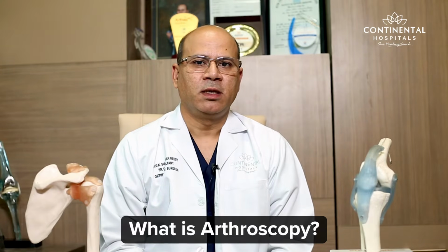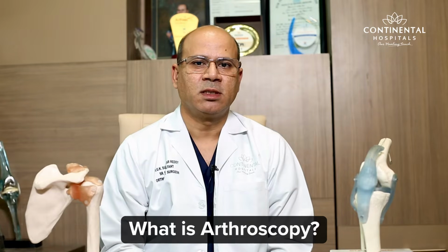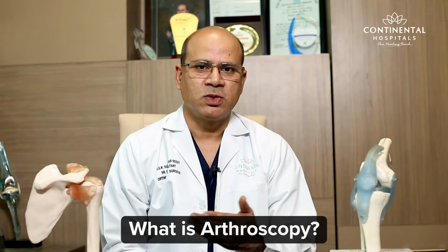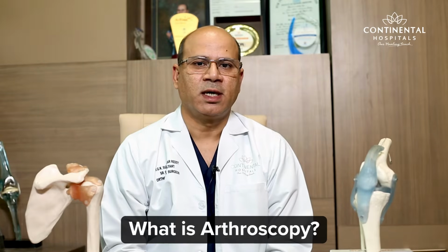Today I am going to talk to you about arthroscopy and its benefits. Arthroscopy is a minimally invasive surgical procedure where we use a camera and pass instruments into a joint to diagnose and treat conditions. Common joints we use are the knee and shoulder, and sometimes the hip and ankle joints.